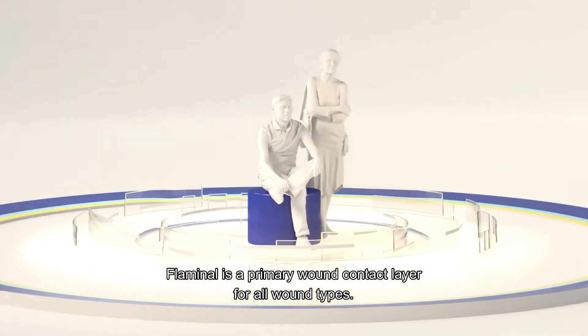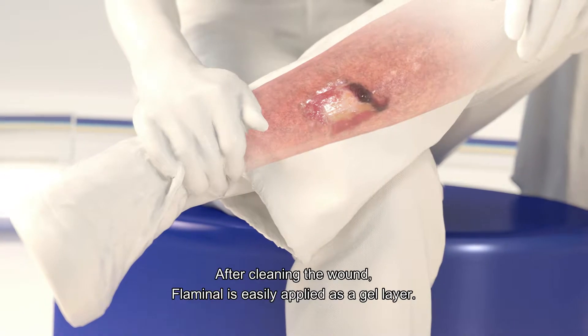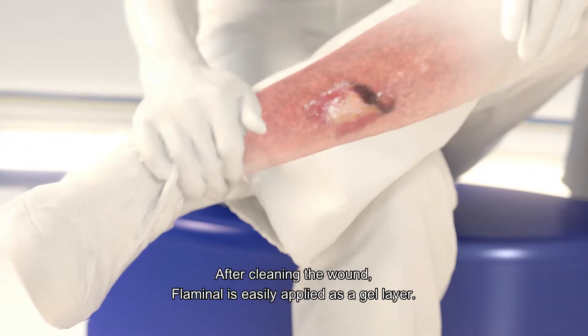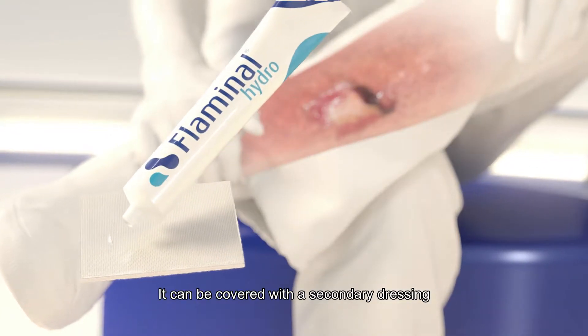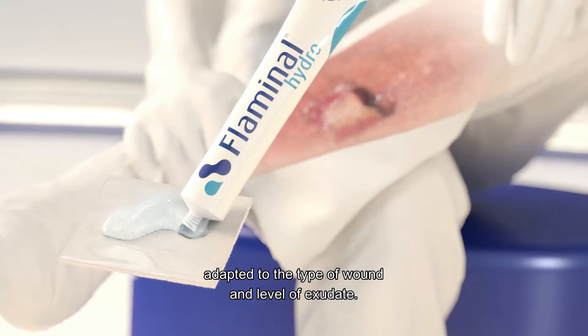Flaminal is a primary wound contact layer for all wound types. After cleaning the wound, Flaminal is easily applied as a gel layer. It can be covered with a secondary dressing, adapted to the type of wound and level of exudate.